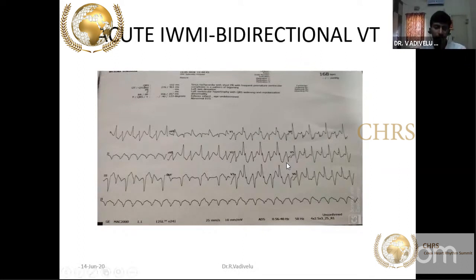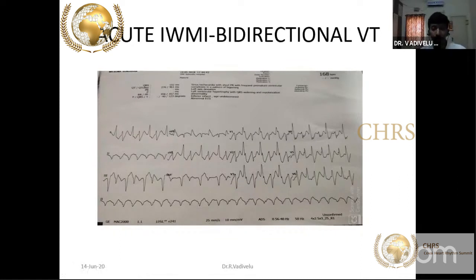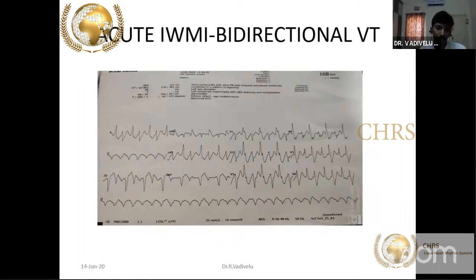In acute inferior wall MI — ST elevation in II, III, AVF — you can see in V1 alternating LBBB and RBBB pattern. This is bidirectional ventricular tachycardia. When VT occurs with alternating LBBB and RBBB morphology, it is bidirectional VT. Bidirectional VT predominantly occurs in the setting of acute ischemia, as does polymorphic VT. Monomorphic VT usually occurs in the setting of old MI.